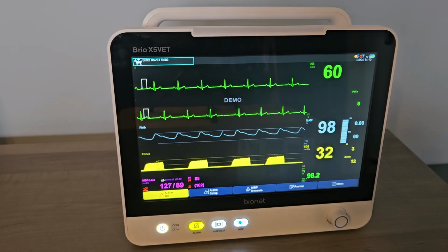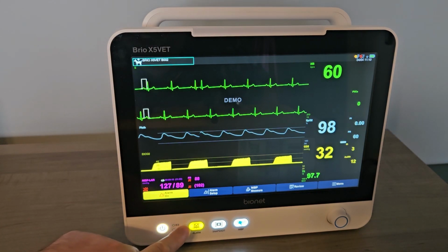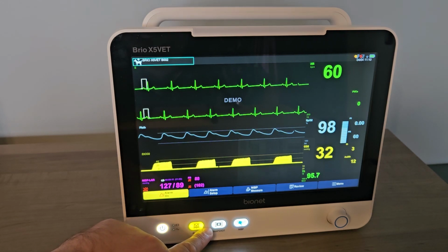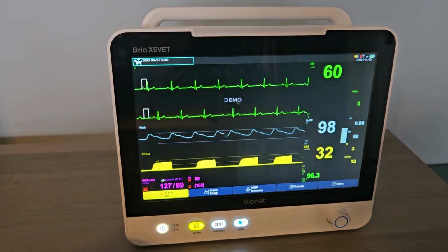Looking at the front of the monitor, the power button must be held for several seconds to turn on or off the monitor. The yellow button is the alarm silence button. The button to the right is the snapshot button. And the last button activates your non-invasive blood pressure readings.